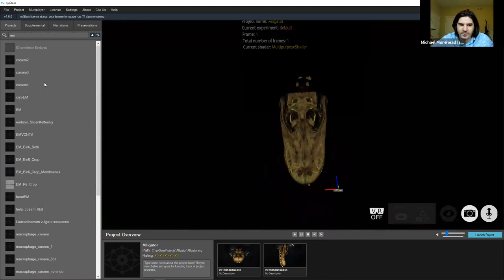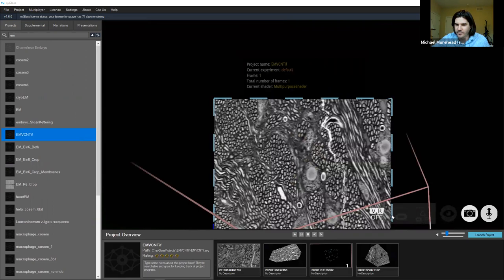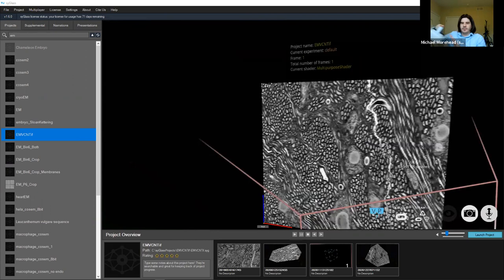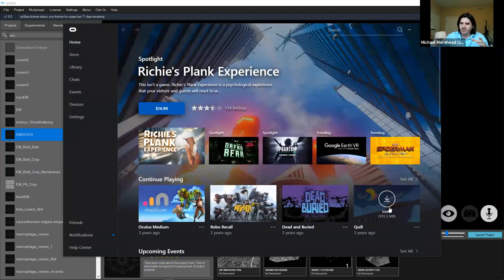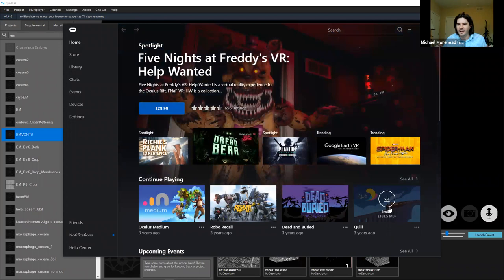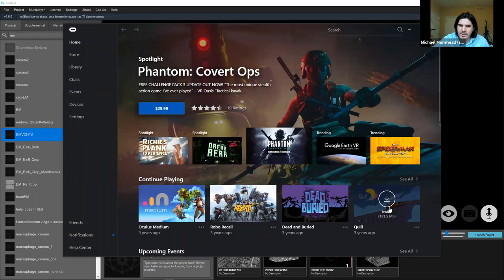We've always been excited about the 3D painting brush, but on some data it's incredibly hard to get contours correct as you move through the stack. In 2D you're projecting along a plane and can draw very precisely. When you have multiple shaped contours moving through Z, it's very difficult — that's exactly where super voxel creation and merging may help.